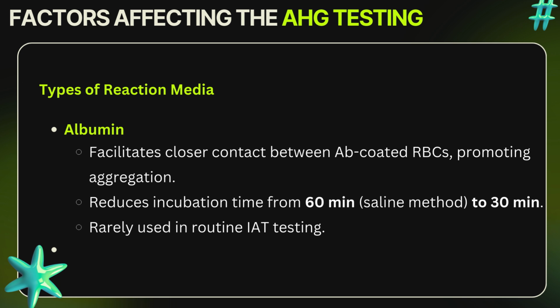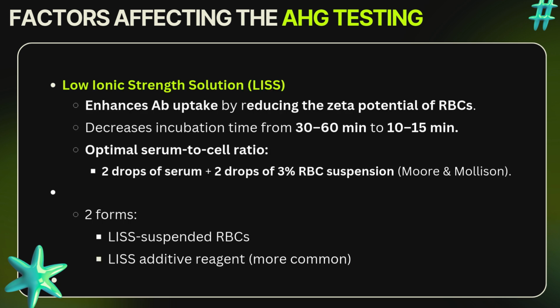This can be a game changer in a busy laboratory setting. However, it is important to note that albumin is rarely used in routine IAT testing. Despite its advantages, other media have become more commonly adapted for routine use. As we move forward, we'll explore another reaction medium that has gained popularity in recent years.